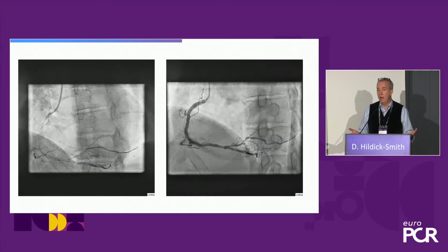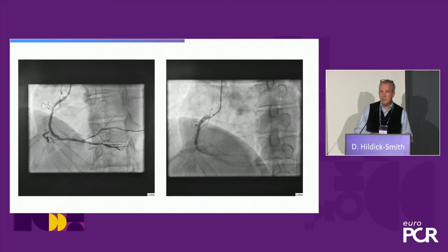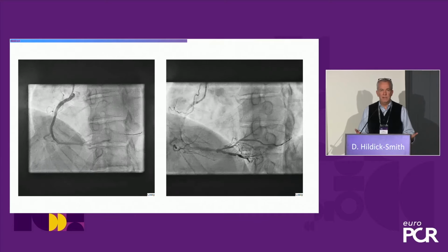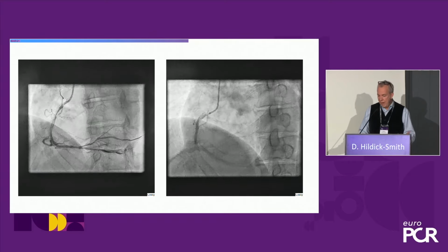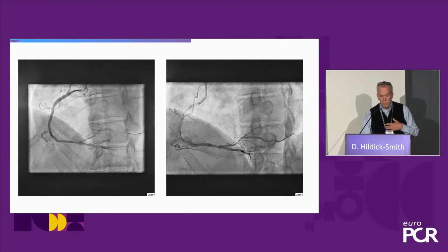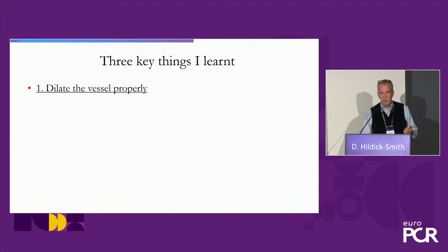It's probably more like a 4mm vessel, but actually if you'd stented it, you'd have put in perhaps a 3.5 at the most. You'd have basically undersized it compared to the reality of the vessel once some of its health was restored. So for me, this has represented a massive shift in how I do angioplasty. And I think so far, because I'm by no means especially experienced at this technology, we have far more experienced people on the panel, but for me, I've learned 3 key things.